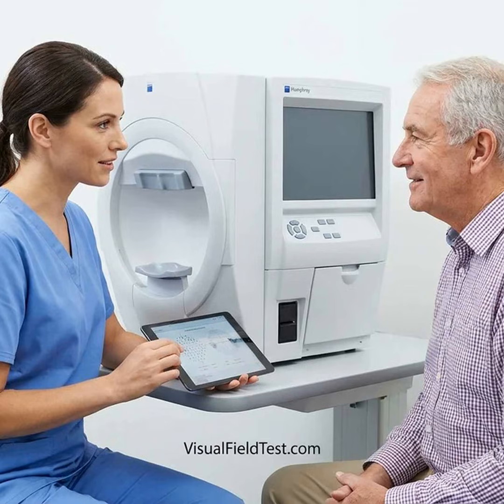Reliability indices such as fixation losses, false positive responses, and false negative responses are useful, but they should not be interpreted in isolation. Modern interpretation also considers the gaze trace, the pattern of loss, test duration, disease severity, and whether the result makes clinical sense.